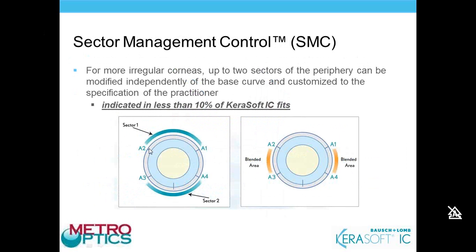Angle 1, angle 2 is sector 1, angle 3 and angle 4 is sector 2. The rule is that these blended areas can't be less than 30 degrees. This is where I rely on the consultants exclusively. They know exactly all of these rules, so I don't have to keep remembering them.